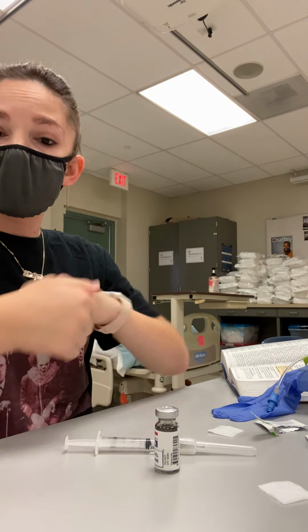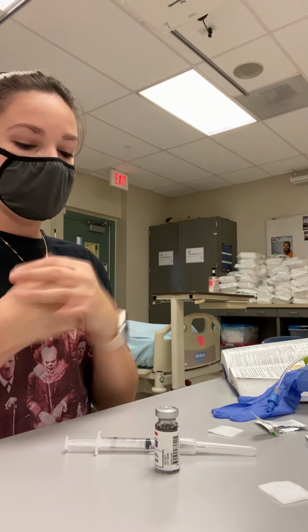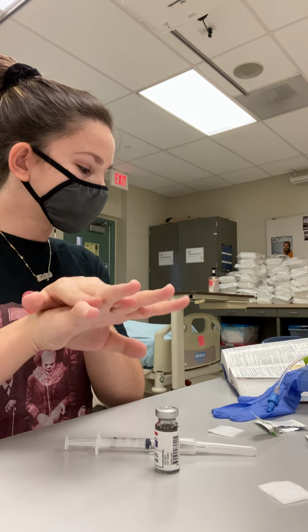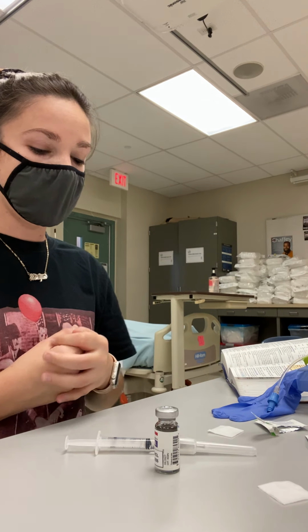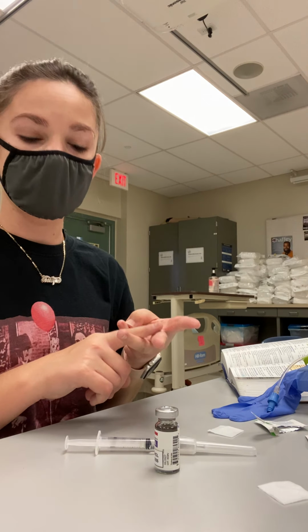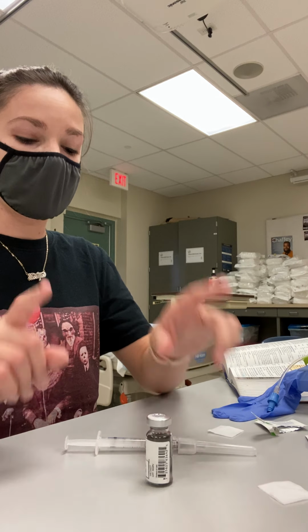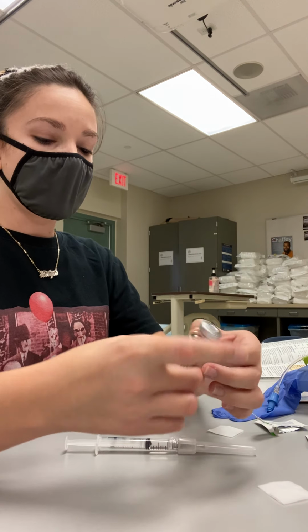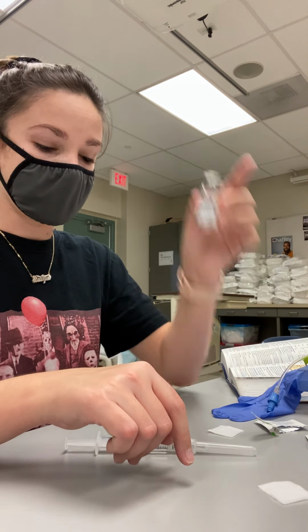And you will walk into the patient's room and introduce yourself and identify the patient. So identify their name and date of birth and their allergies. And you will do your third check. So you'll scan the med and verify it with the computer: the medication, the dose, and that the vial is not expired.